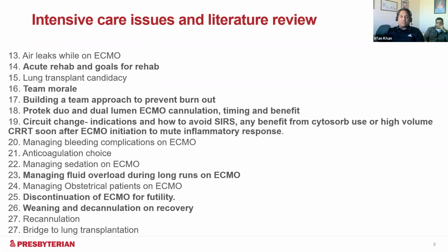Managing fluid overload during long runs of ECMO, that's an important topic, because I think all of us, as soon as the patient stabilizes on ECMO, we are happy that things are going fine. We don't pay attention to the day-to-day fluid balance issues. We don't tweak things. We don't make changes. Some patients may be getting iatrogenic fluid overload. We don't pick up on that in time, and then the patient ends up getting adversely affected. Obviously, there's data to prove that fluid overload itself is an independent risk factor for mortality. So anytime you reach 10 to 20% fluid overload, then your mortality rate goes up. So that's something that we have been closely watching at our center.